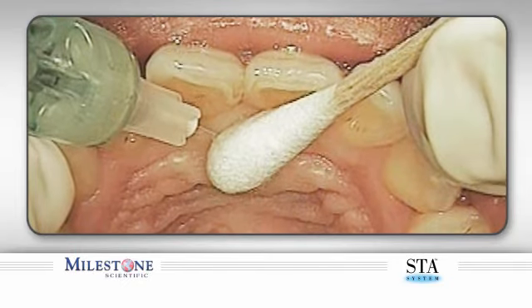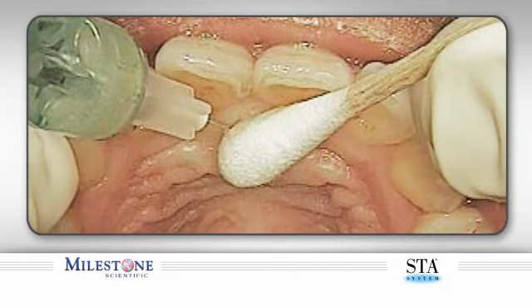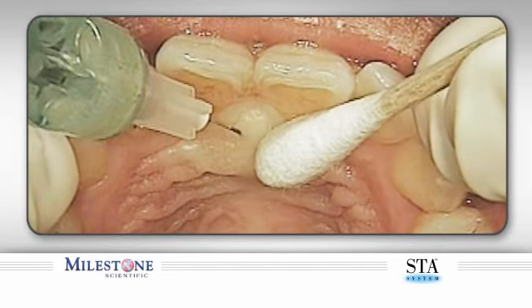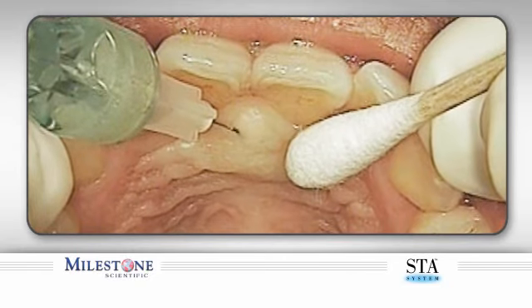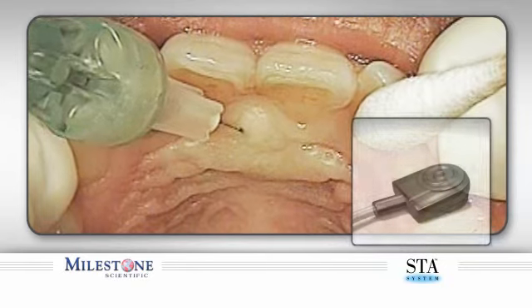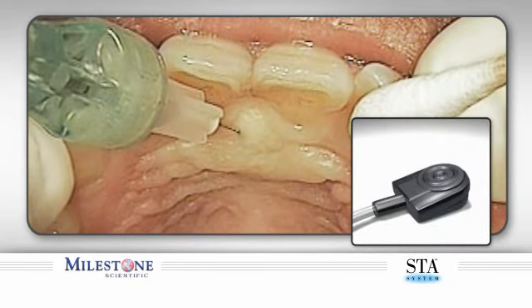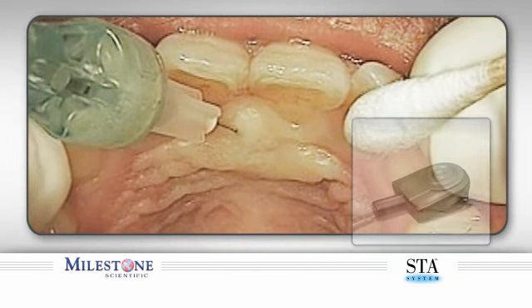All movements must be performed very slowly and gently. Do not move the needle more than 1 to 2 millimeters forward each time. Rapid movements are contraindicated. When the needle is in the canal and contacting the inner bony wall, stop movement and aspirate by depressing and releasing the foot control pedal. Do not exceed 3/4 of the needle length penetration into the canal.